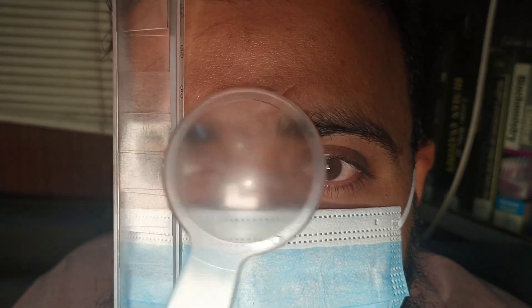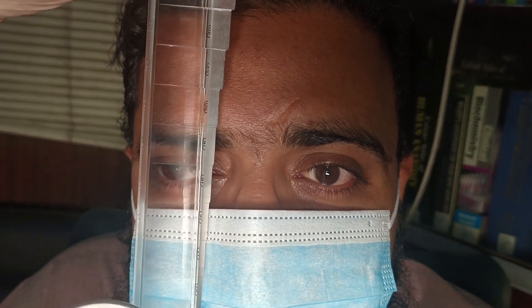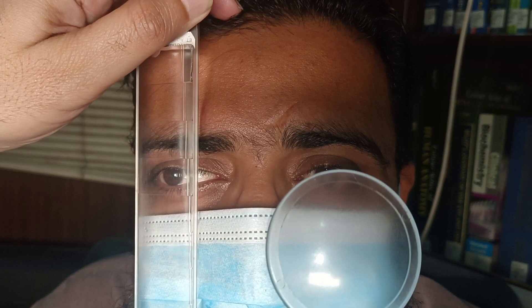What we want to see is the movement of the eye. You can see the eye movement on this side — once I move the prism, the eye is not moving on that side quite as much. We can see the amount of exotropia coming out is about 18 prism diopters on this side. Let's increase it and see if there's any change in the type of squint.